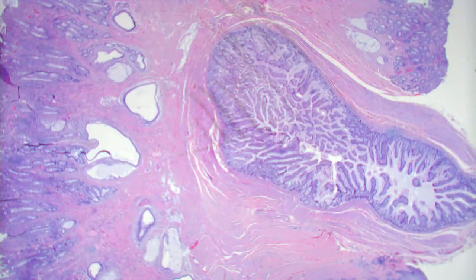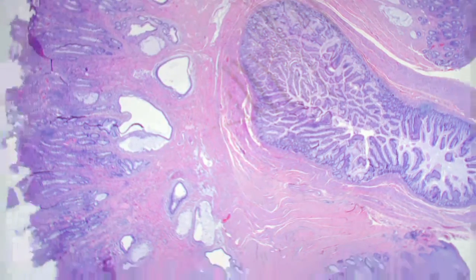What do you think this would have looked like clinically? Would it have been a smooth surface lesion, or? No. It's kind of eroded, isn't it? It's got some neutrophils on the surface. Why do you think that is? There's infection? It could be, but we don't see any bacteria up there. No.